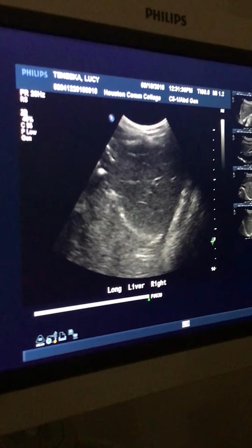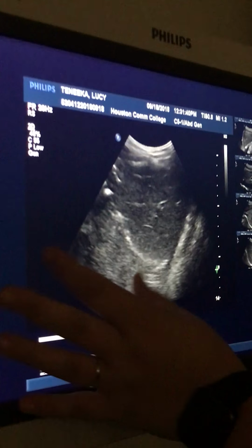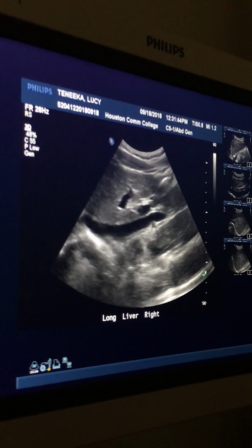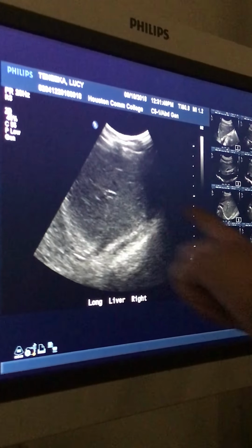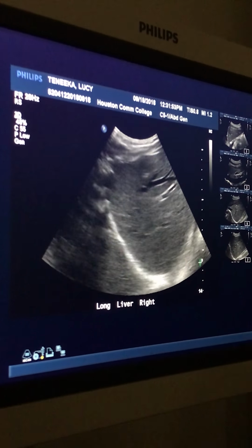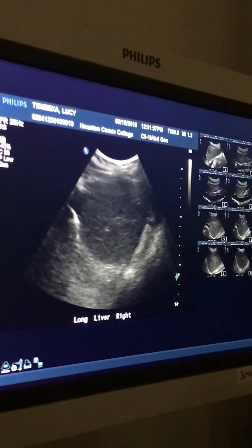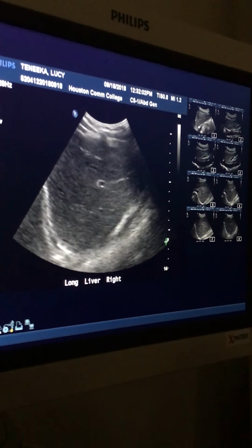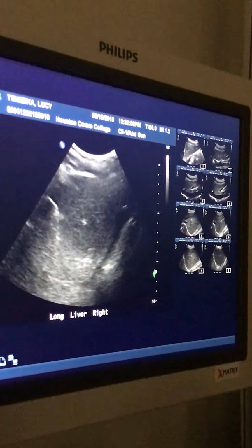Be careful when you're taking this picture. If you look, the space between here and here and here and here is even, right? Like your U is even. Sometimes you'll get a lot of this, or I see a toe down, and then you get all this dark area. Or if you're too heel down, it'll go that way. Make sure you're centered, your U is centered. So how do you do that? You can slide down the body, slide up, lateral, medial, toe, heel. Toe, heel is going to move it drastically. So just watch your angles and your toes.